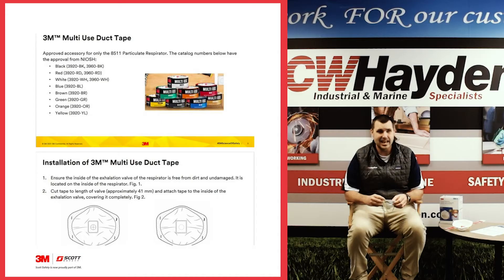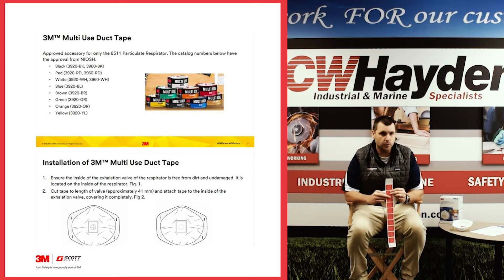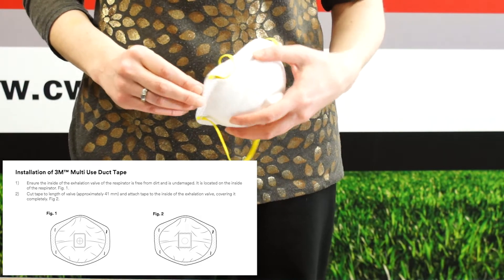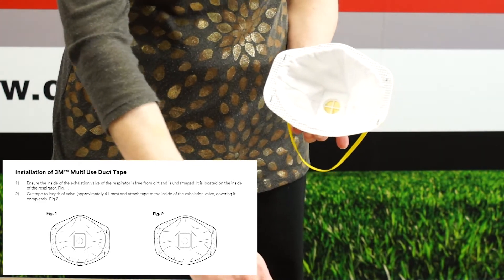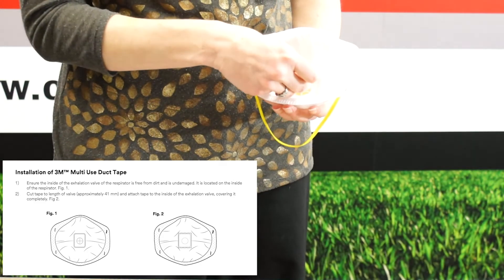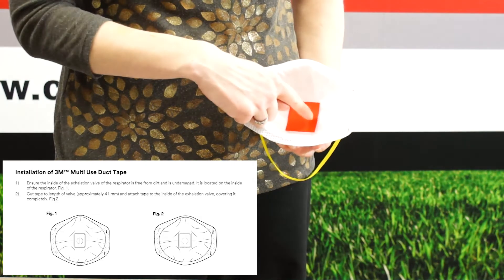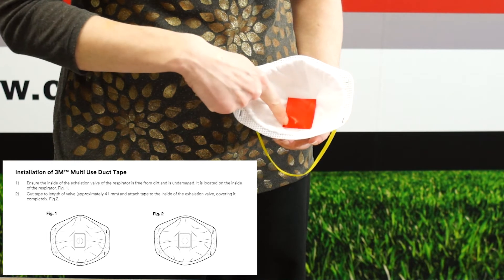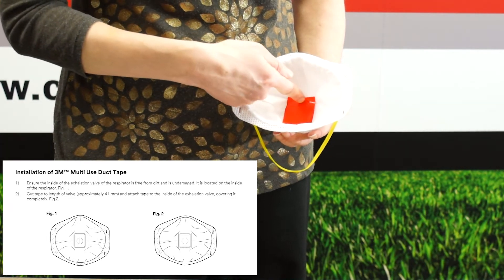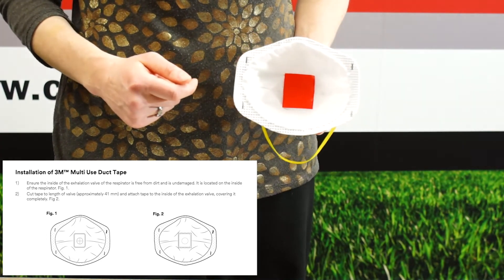So what 3M has done is they have gotten NIOSH approval to use 3M 3920 duct tape. What you do is basically take the duct tape and put it over the inside of the valve. There's a little rectangle in there you need to completely cover — that will block air from going out. It does not affect the integrity of the mask. You still get the N95 level of protection, and it comes with NIOSH approval.